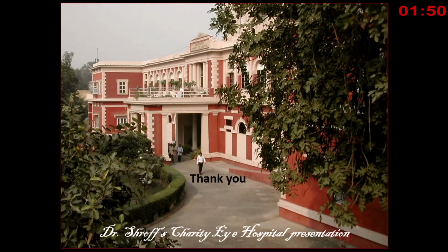Thank you, Manisha. A new idea is emerging in this country: can you self-image your retina and then decide when to go or not to go to a physician or ophthalmologist? The idea comes from your clinical thermometer. Now you measure your temperature, you say up to 99, I will tolerate, up to 99.6, I will take a dolo, crosses 100, I'll go to a doctor, etc.